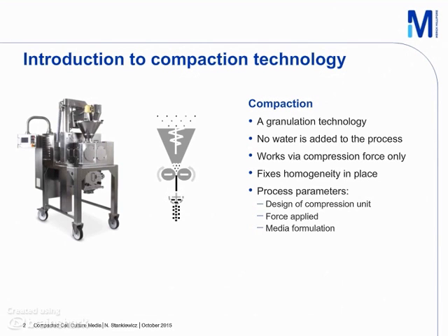Compaction is a granulation technology, but importantly, a dry granulation technology, where no water or other additives are added to the process. Compression force alone is used to form the compacted media. The process is controlled by the following production process parameters: the design of the compression unit, the force applied, as well as the media formulation.